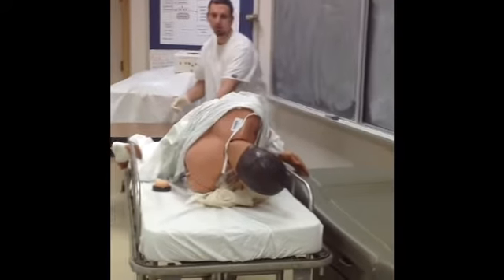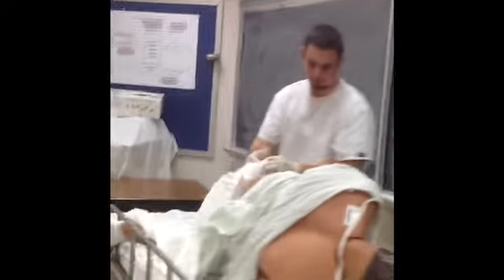Assistant, can you come over here please so the camera can see what I'm doing? You put the camera on the site.